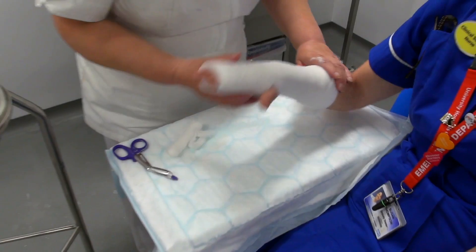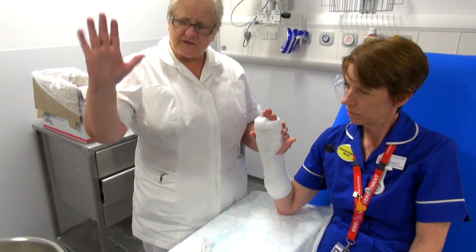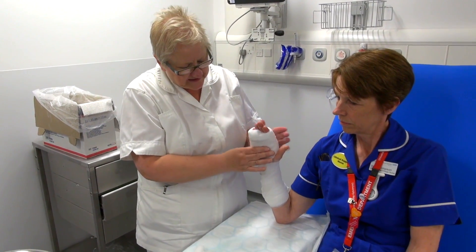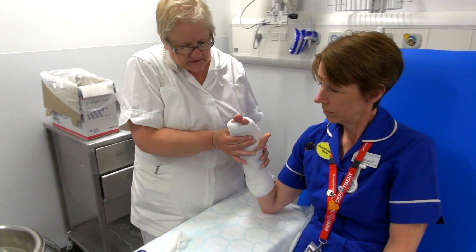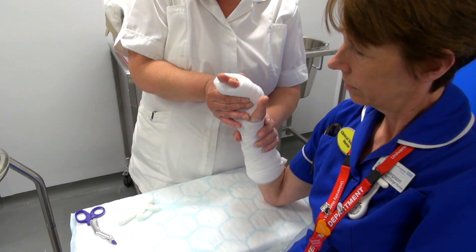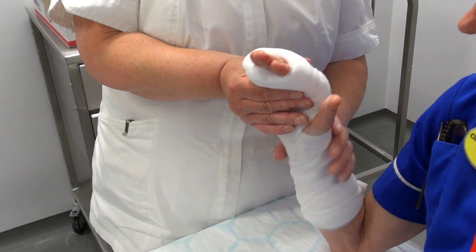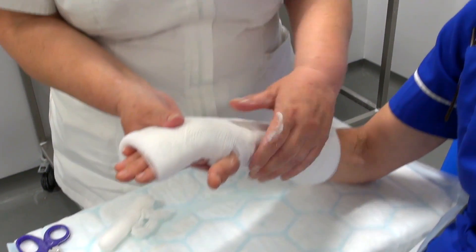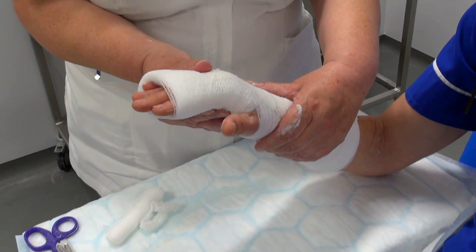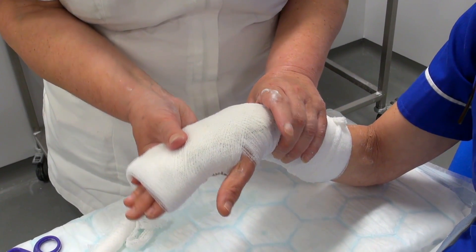Sue, if you could just put your elbow down for me. Because it's straight like that, you don't stand with a straight hand — you always stand with a little bit of a bend. So you just put it in a natural position, bend your hand slightly. The one thing with this is sometimes your wrist bends — you just have to make sure it's in a nice position and not out of shape.